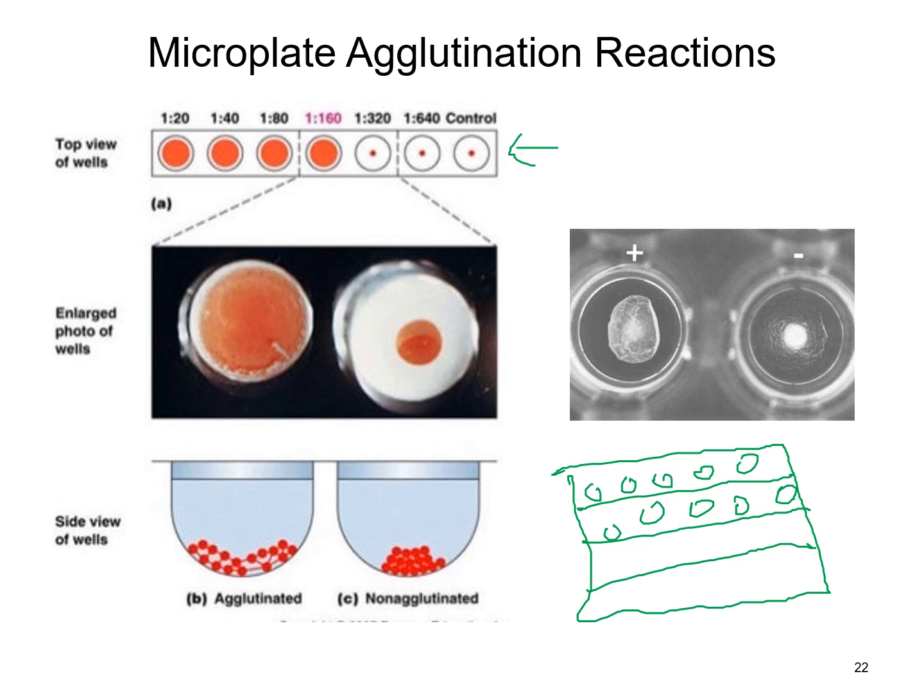Now in the bottom of each of those wells, depending on the particular test that you're doing, some of these may actually be coated with something around the edges of this well. So once you put the reagent and everything in here, allow it the time to react, then what you actually have taking place is binding to the side of the well. Whereas if there is nothing there to actually bind, then everything will just flow down until it comes to a stop here at the bottom and all piles up together.